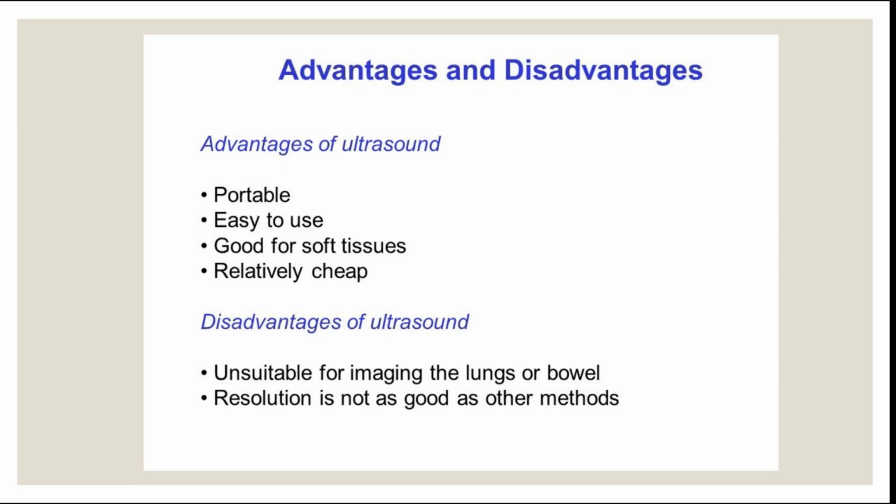Do you know, when can we use ultrasound, for example, to look at the brain? Is it possible to look at the brain using ultrasound?